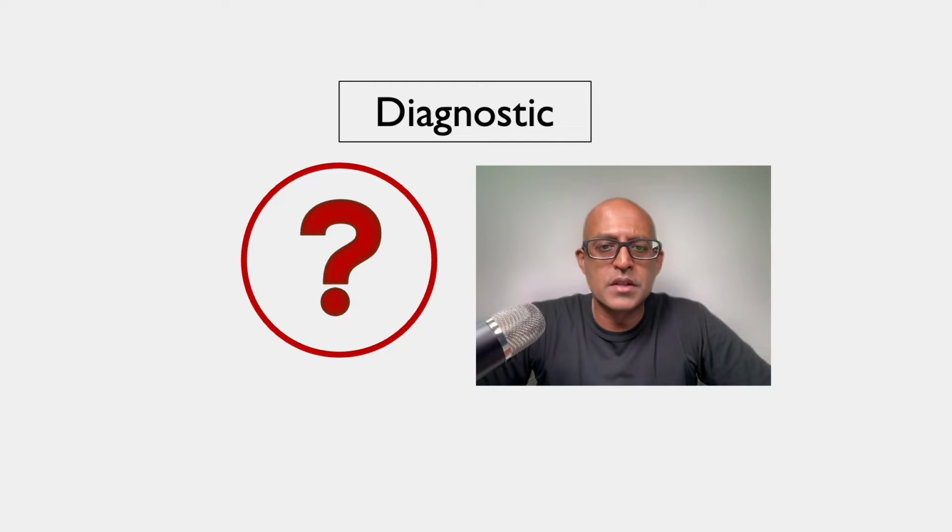So let's think about it from a diagnostic perspective. Why are we trying to use the ultrasound injection for diagnosis? Well, an example is if the patient is experiencing pain. We can use the local anesthetic that's included in an injection to reduce the pain symptoms. And in doing so, if we identify the location of the pain, then the ultrasound injection is helping us with the diagnosis. Because we can guide it to a particular anatomical spot, the clinician can therefore take it that, having performed the injection into that area, this is where the symptoms are coming from.